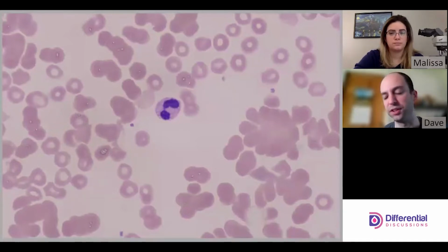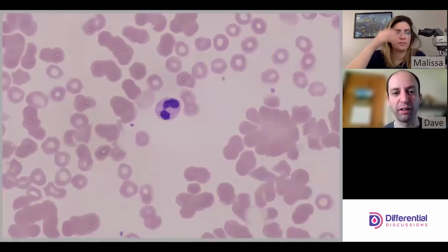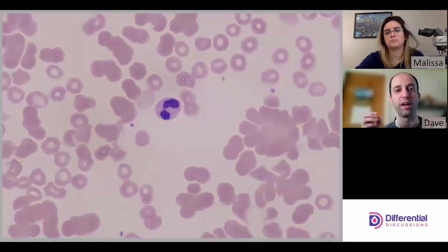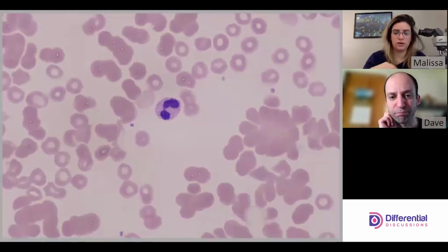There are things we might do to run the CBC, but we're not going to address that here. What we see is this cross-linking of red cells to one another via these antibodies, likely IgM class. Antibody-antigen interaction. That's what agglutination is.